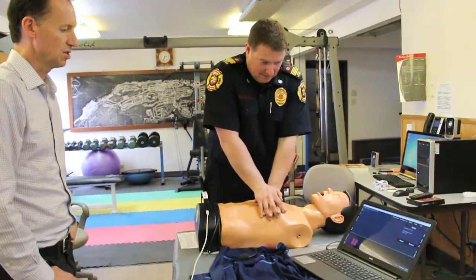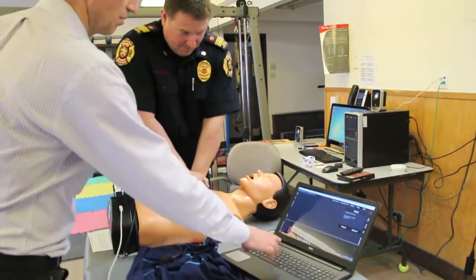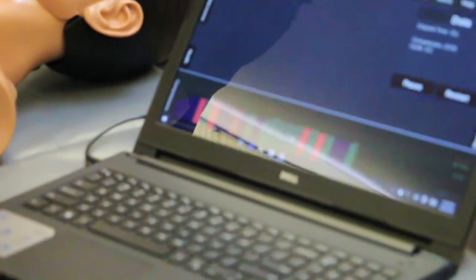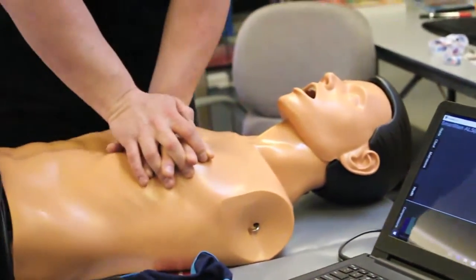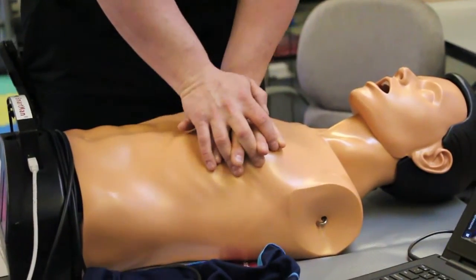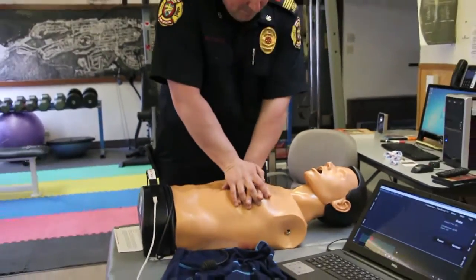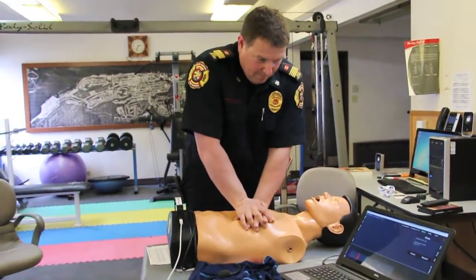Okay, slow it down just a touch. Good. Now a little deeper, a little deeper — get that green, get that green. Perfect, that's perfect. Very good, excellent — just like a piston, very consistent. He's doing very high quality, consistent CPR; that green bar is just coming right across.